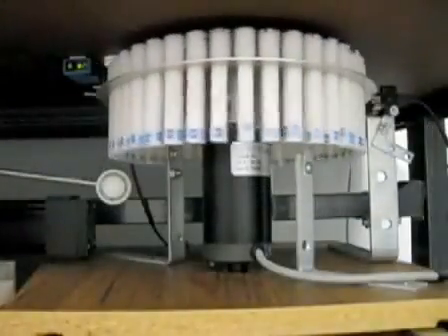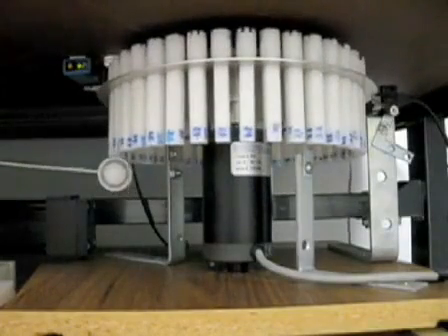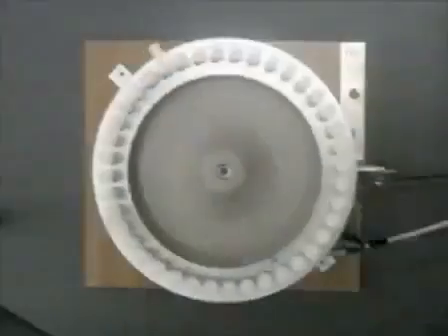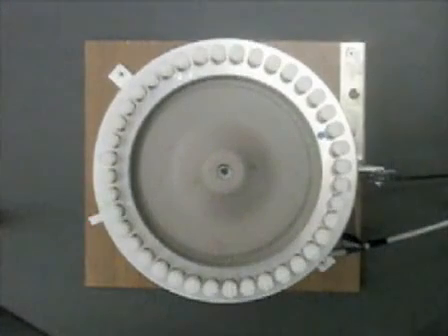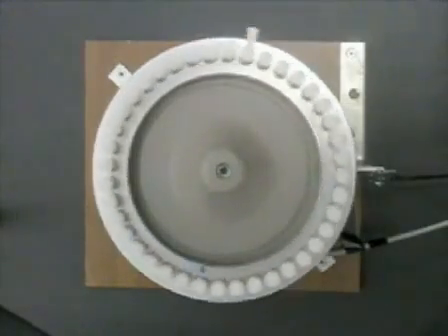In addition, activation of the sensor disables the stepper motor, preventing equipment damage that would otherwise occur should a stimulus piece accidentally jam in the tunnel. A U-shaped photoelectric sensor establishes the home position for the stimulus tray. This sensor is activated when a piece of stiff paper glued to the rim of the rotating tray breaks the infrared sensor beam. All movements of the stimulus tray are subsequently calculated relative to this home position.